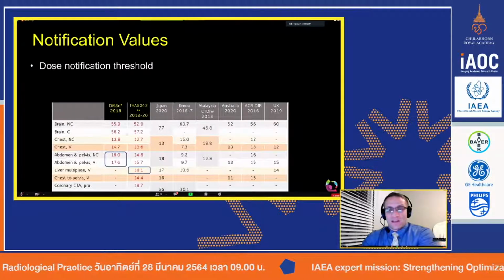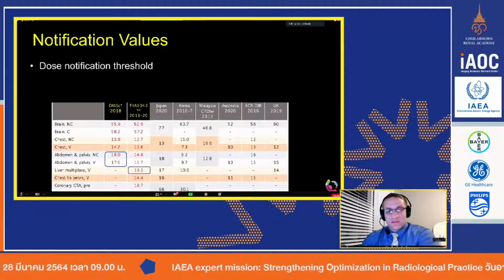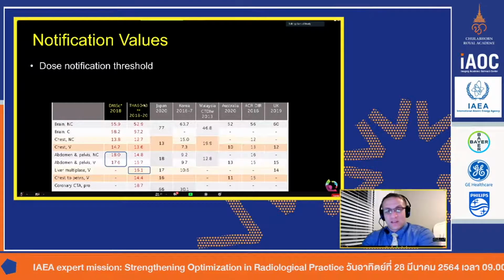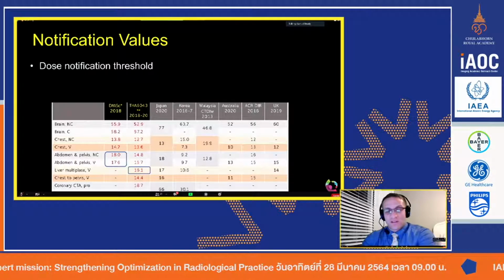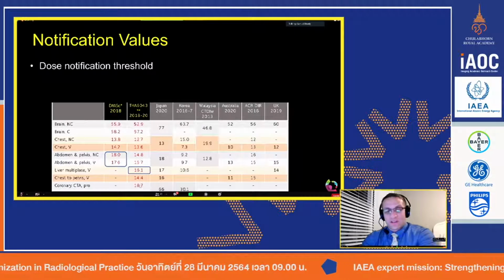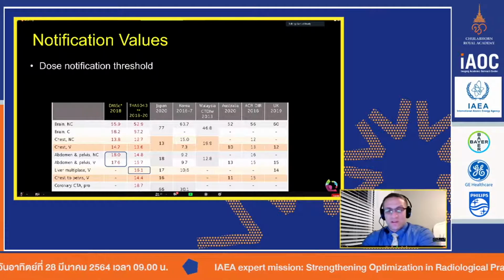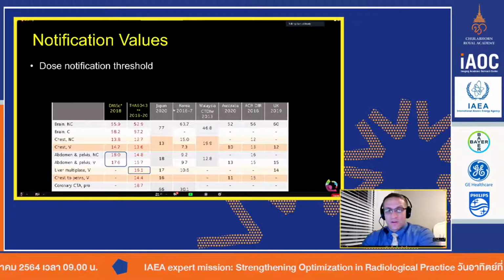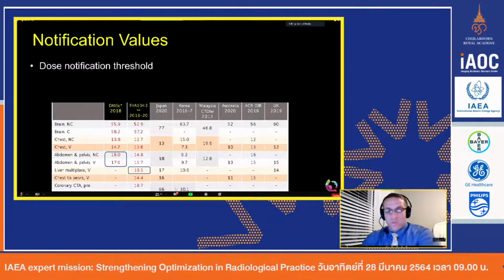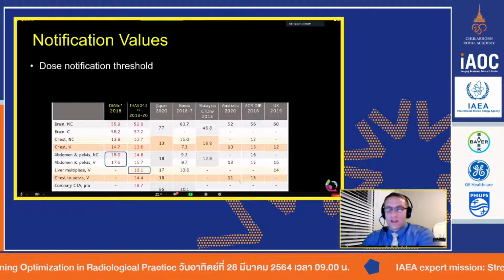So looking at the data that Dr. Panayottai developed, of course, they have some coronary CTA exams, and they looked at prospective versus retrospective. And looking at these values, you can see national diagnostic reference levels are set for the prospective, roughly just shy of 19 milligray, and for the coronary CTAs in retrospective, a little over 60, compared to your fellow compadres in Japan and Korea, and they only have just one value for the two. The US over here in the West really don't have any values.